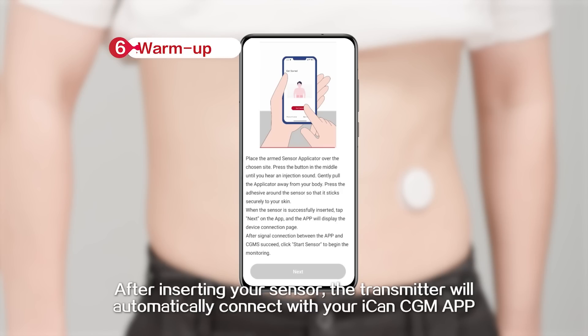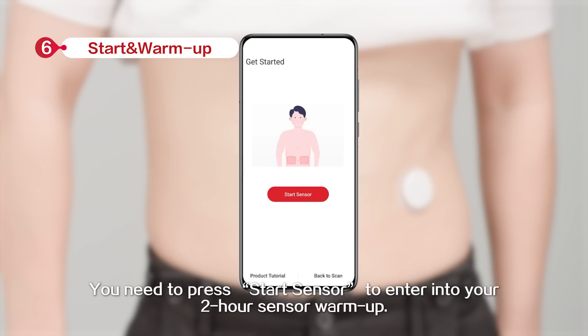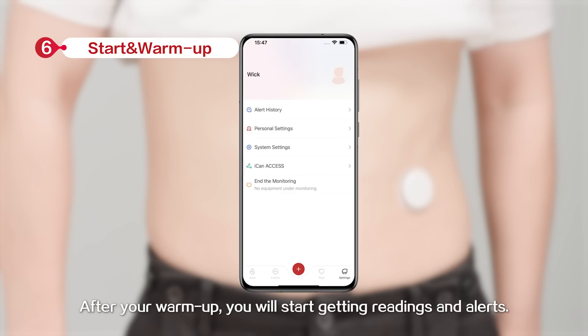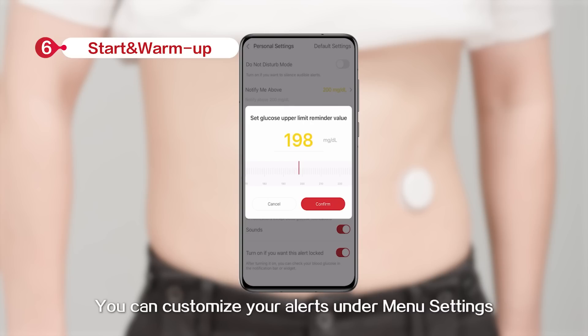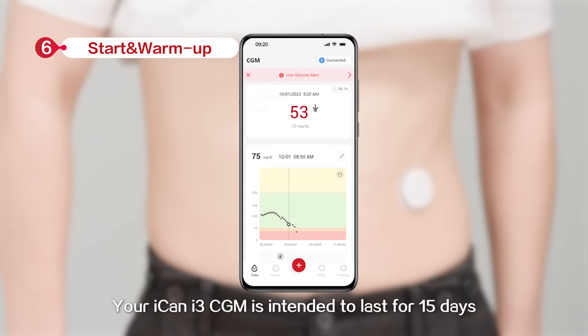After inserting your sensor, the transmitter will automatically connect with your ICANN CGM app. You need to press Start Sensor to enter into your 2-hour sensor warm-up. After the warm-up session, you will start getting readings and alerts. You can customize your alerts under menu settings. Your ICANN i3 CGM is intended to last for 15 days.